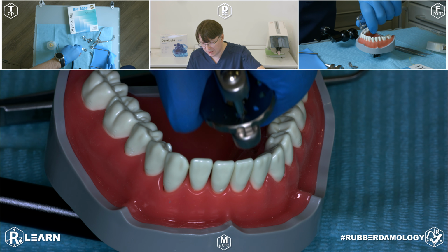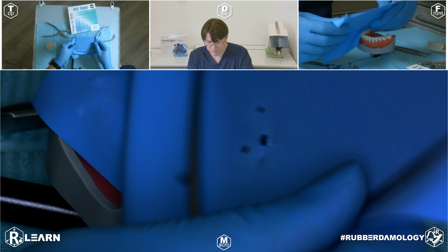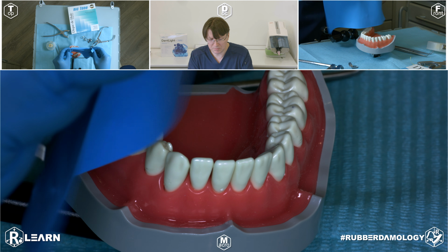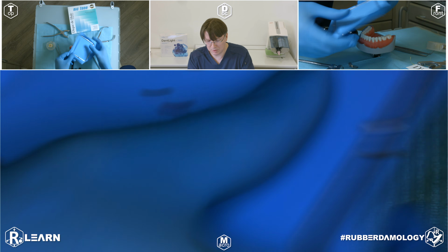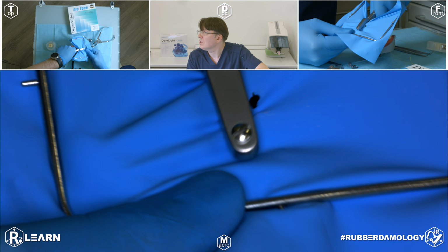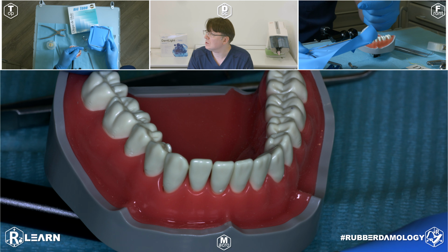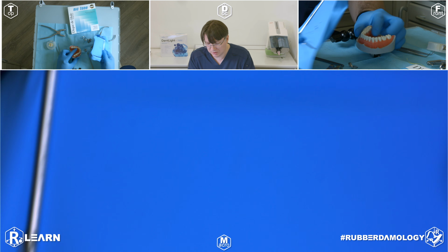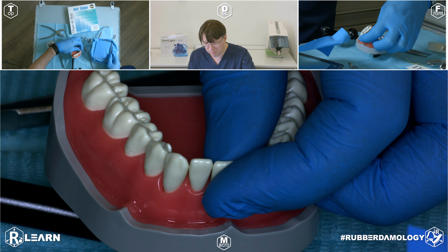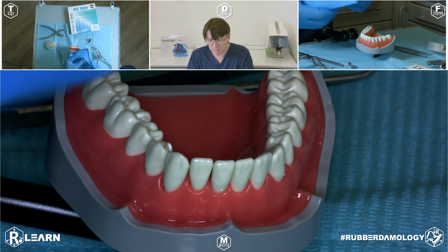For incisors, lower incisors, the smaller hole on the puncture. And I also decide to rotate my rubber dam. So you can use your rubber dam for these exercises sometimes. Perforation for incisor. And if you work with only one tooth, you can make one perforation. But sometimes it's very hard to put the rubber dam directly and fix the clamp on the neck of the selected tooth, because you have very big tension of the rubber dam perforation margin.